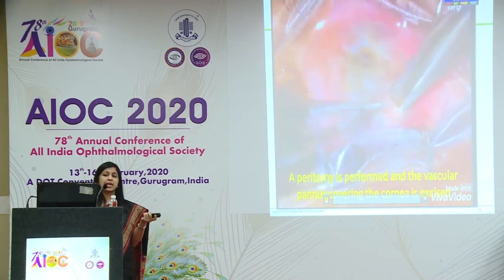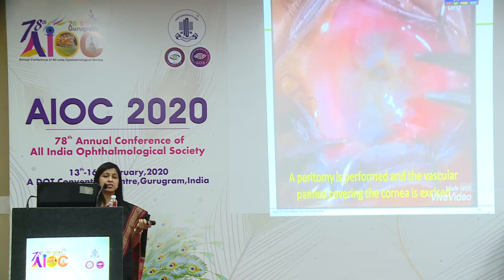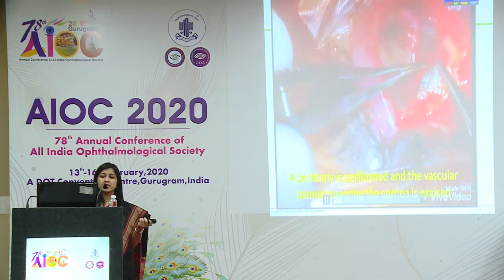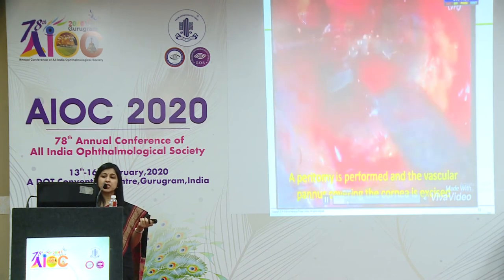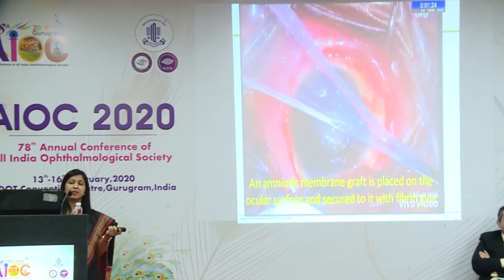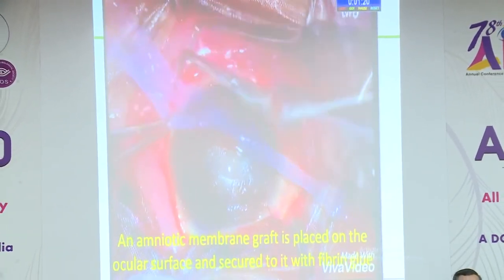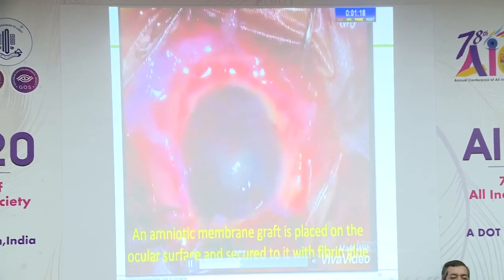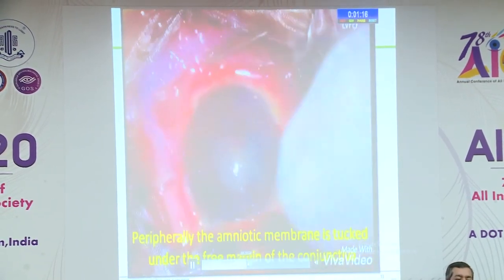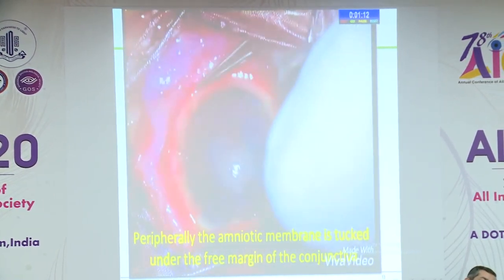the cornea was barely seen. So first, of course, we do a peritomy and the vascular pannus covering the cornea is totally excised. Once the proper excision is done and you've exposed the surface, put an amniotic membrane graft over it, secure it properly with the help of fibrin glue. And once you've secured it well with the fibrin glue, you take a limbal biopsy from the contralateral healthy eye, if you have one at that time.